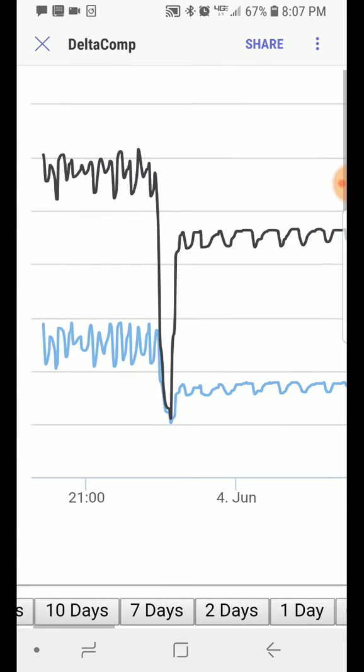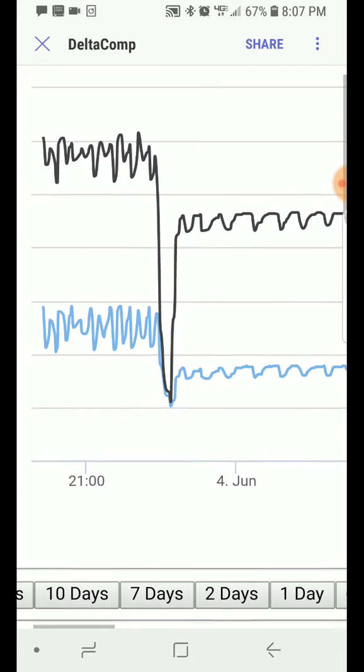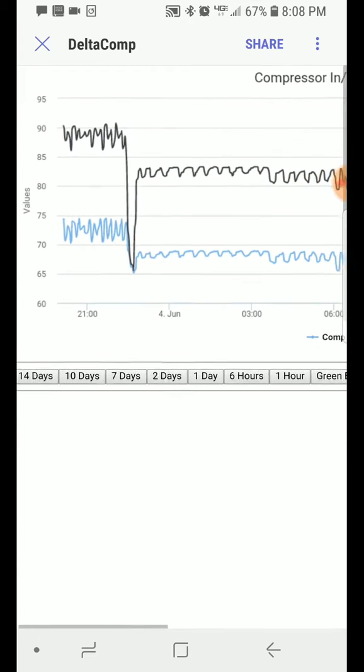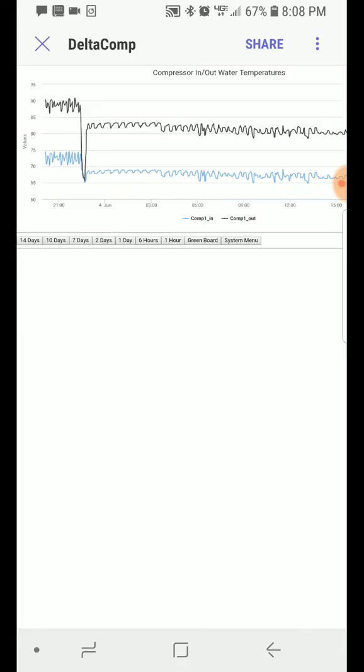So this is what it looks like when the helium compressor stops working all of a sudden, but the chiller continues to work. The outgoing temperature comes together and meets the incoming temperature very quickly.